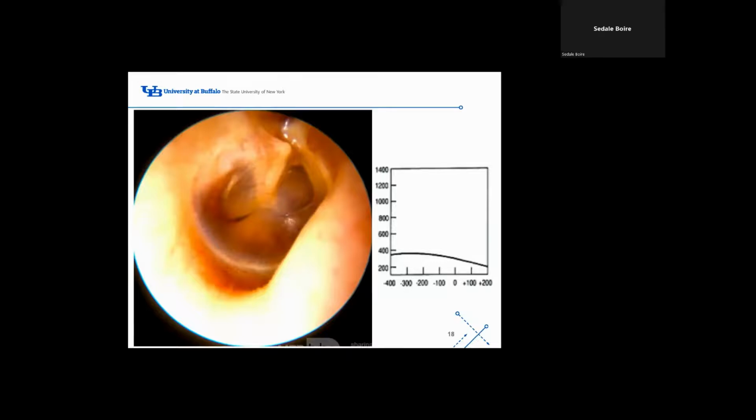Meniscus, middle ear effusion. You're right. So this is actually also the diagnosis of otitis media with effusion, because we can see this straw-colored, thin, watery exudate in the middle ear space, and it has these air-fluid levels or bubbles right there. And it matches up with this tympanogram.